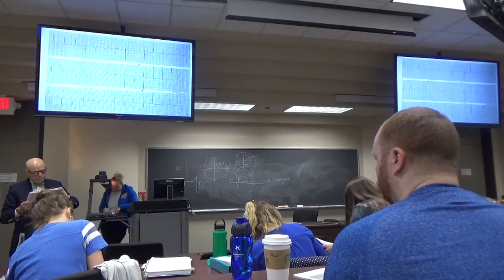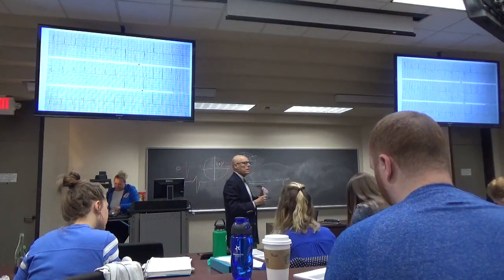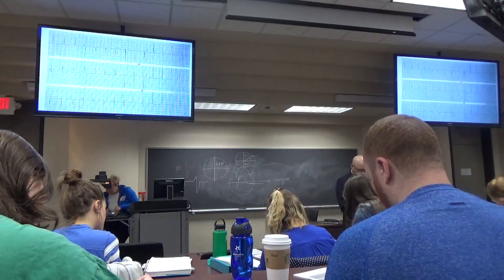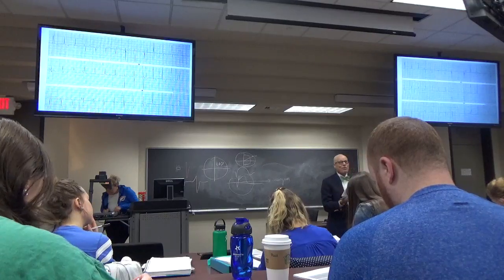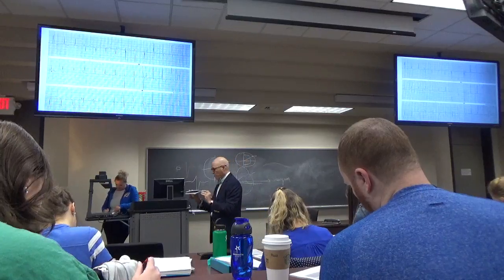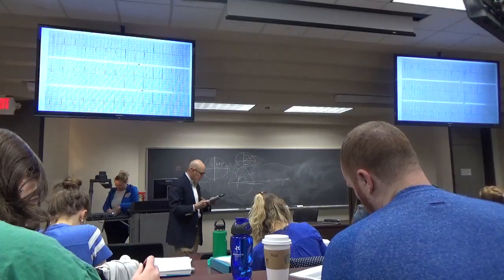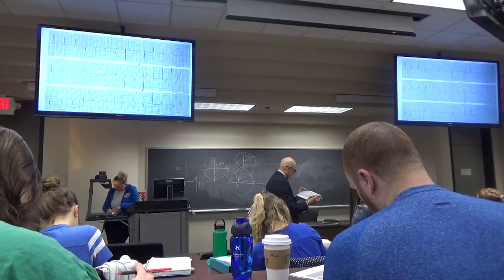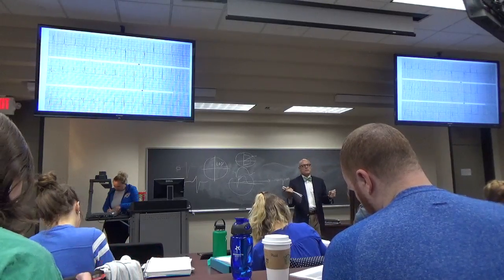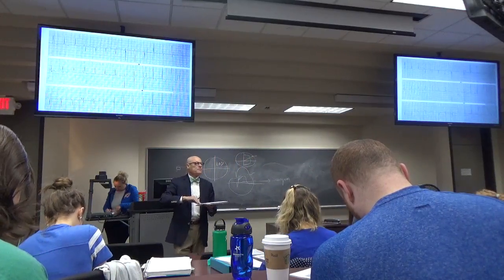Did you call this lateral ischemia? Yeah. Anterior, lateral, inferior. Everybody got anterolateral ischemia? T waves are down in 1 and aVL. They're down in V3, 4, 5, 6. Would it also be inferior? And also in the inferior leads. At least in 2 and aVF, they're flipped. So there's probably inferior ischemia as well. Or at least primary T wave changes.